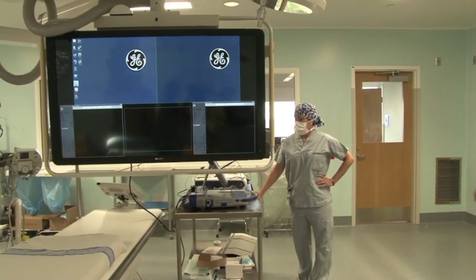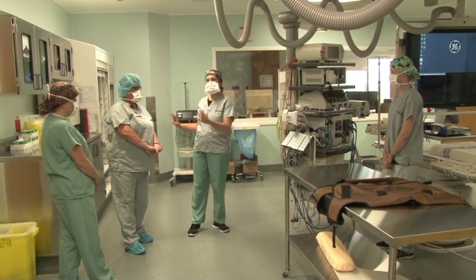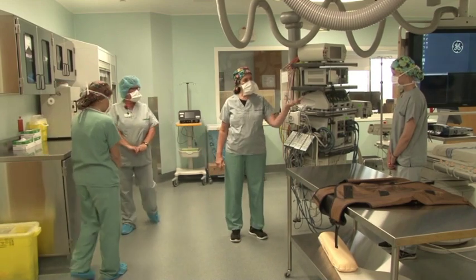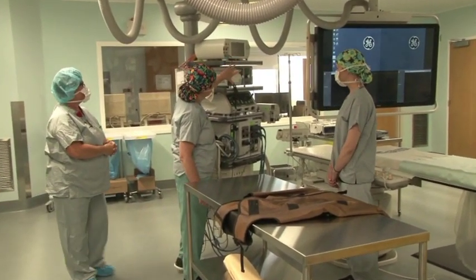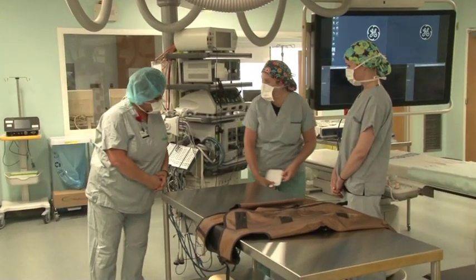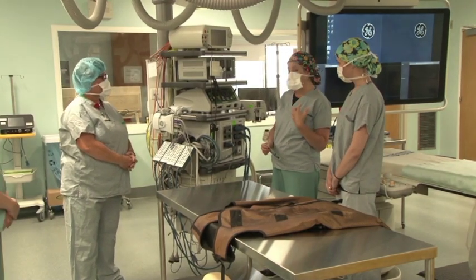And I'll take you around to the other side of the room and show you where we hook them up to cautery. So Sue and Brandy, we're on the other side of the room, and this side of the room has all of our pacemaker ICD supplies. And the patient is on the table, hooked up to the monitors. The last thing that we connect to them is to be grounded to cautery. And there's a cable that comes down from the cautery equipment, and it's connected to a grounding pad that we put on the patient's outer aspect of their thigh, because we do use cautery when we make our little incision for an ICD or pacemaker.